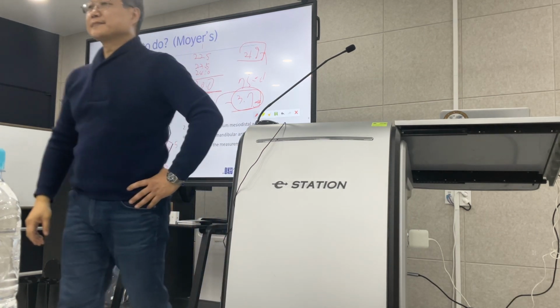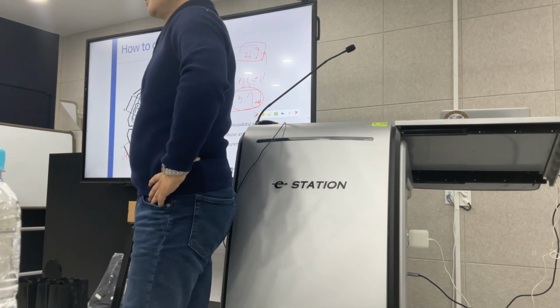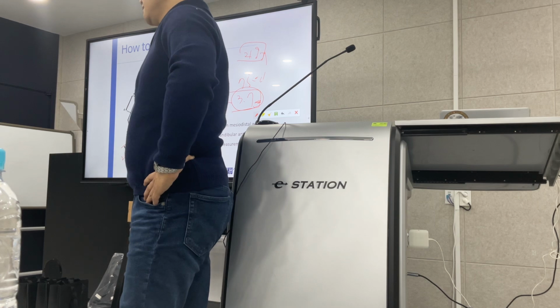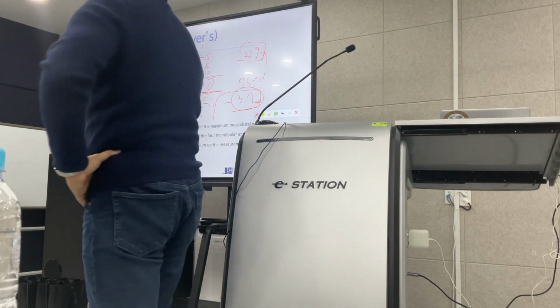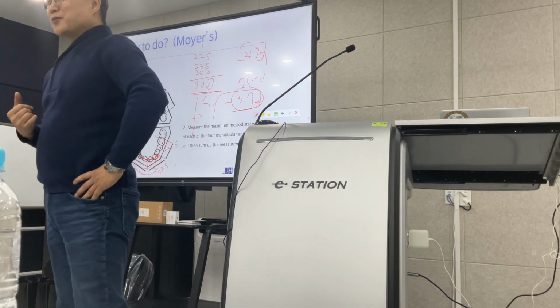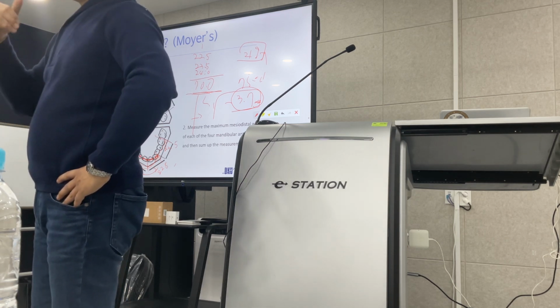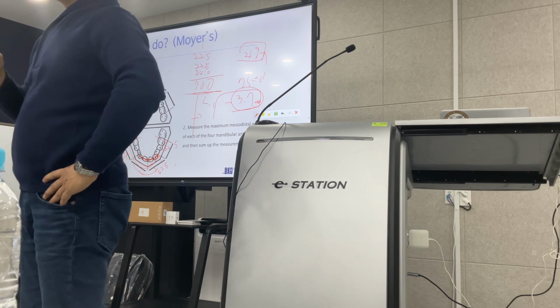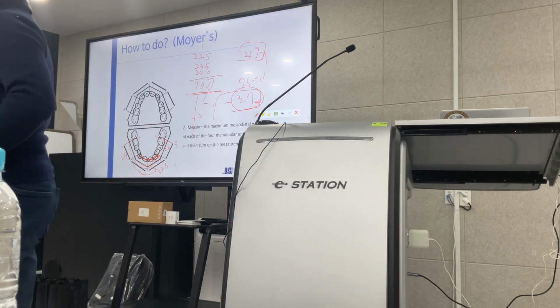Anyway, actually for this program, I prepared 30 upper and lower 3D models with my 3D printers.